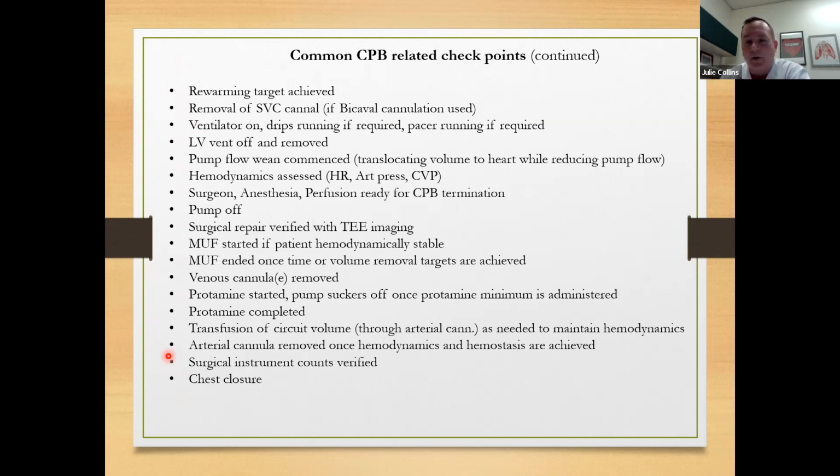Sometimes in a dire emergency, you can't completely do a checklist, okay? Sometimes you're going to be faced with that. But 99% of the time, when you have time to do a regular setup, you have to do your checklist, and you've got to be pretty precise with it. It's not the time in the case to skip through and just check boxes.